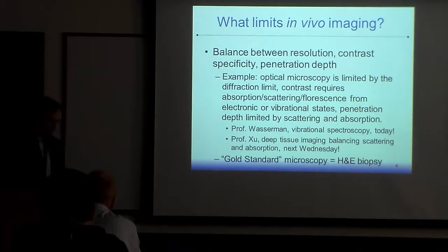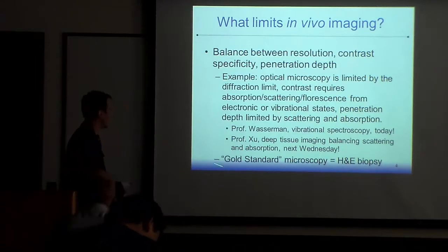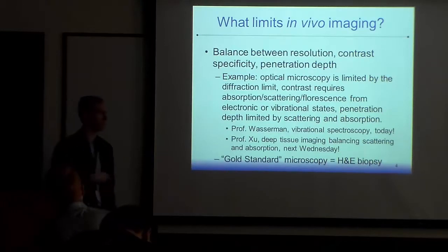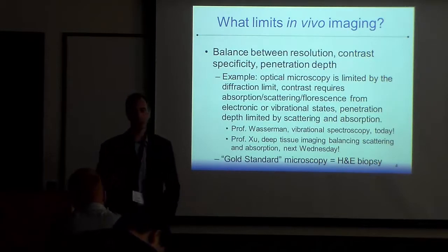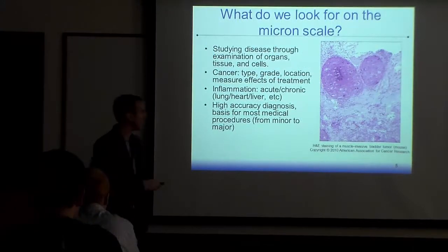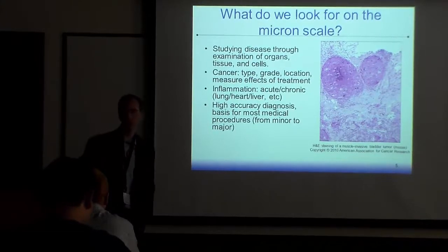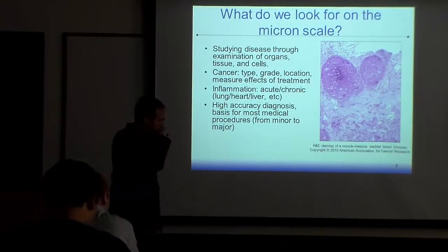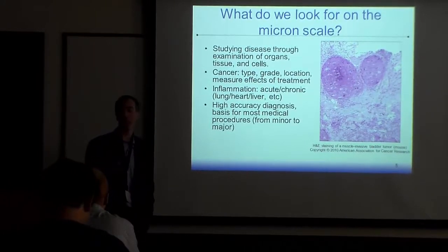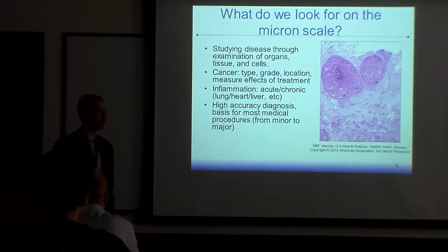And I guess if you're going to start talking about optical microscopy and thinking about, well, what are we currently doing right now? We could just take a brief look at the gold standard of microscopy, basically of tissue diagnostics, which would be the H&E biopsy. And this is the slides you would get. Basically, it's a tissue that's stained, and you can have a highly trained medical doctor who can look at this and say, with extremely high accuracy, okay, I see a tumor here. It's well localized. It's not really spread very much, and I can diagnose the grade and the level of inflammation. What type of cancer is it? Is this metastatic from kidney, and it's actually in the brain? Or they can look at all these different things to come up with this diagnosis and a plan for treatment.